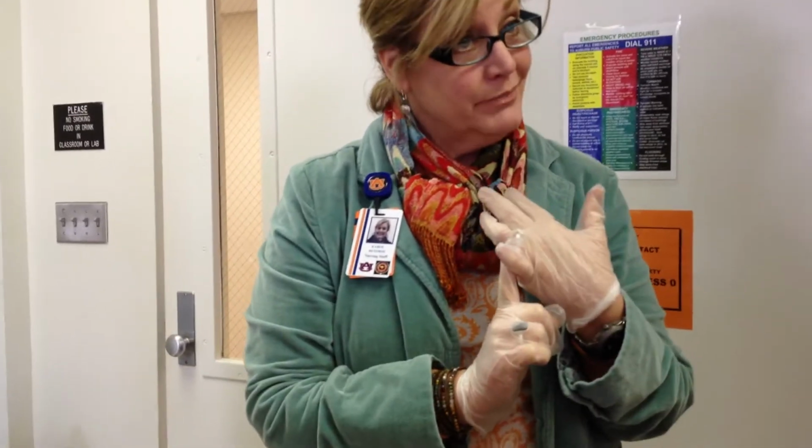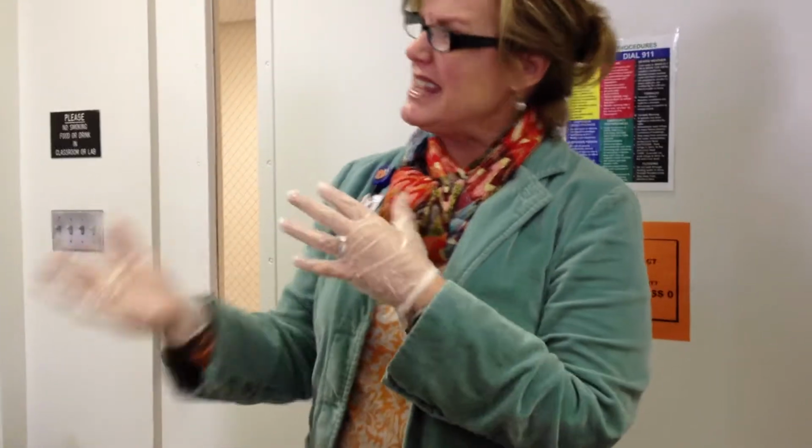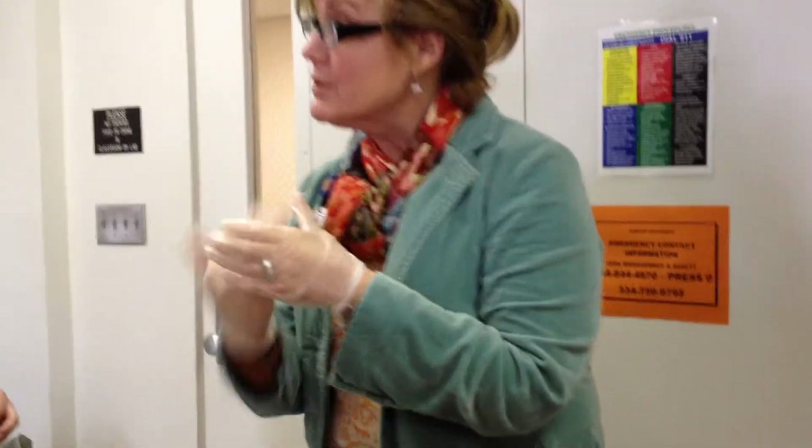But then hopefully you will have already gone and evaluated your patient, because you're going to need to know your patient's size. You're going to need to know, kind of how big they are, kind of what you're giving. Is it thick? Is it a thin medicine? Because that will help you get the appropriate gauge of needle. If it's a thick medicine, you're going to need a larger bore needle because it won't come through that tiny little needle bore. If it's a big patient, you're going to need a longer needle in order to ensure that you're getting past the subcutaneous tissue and truly getting to muscle tissue.